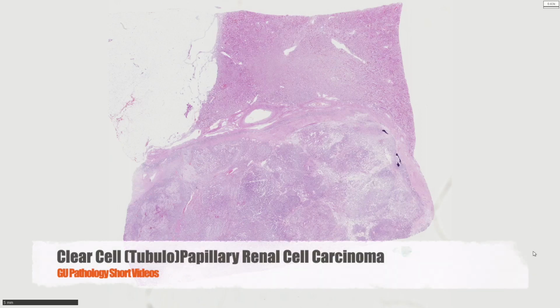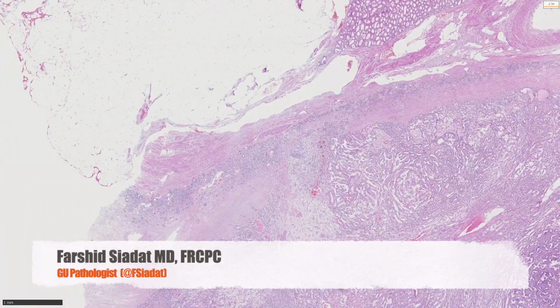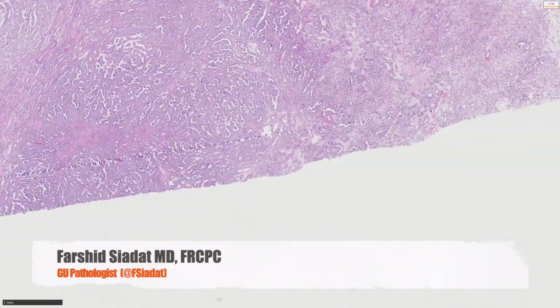In this video, I will share and review a distinct type of renal cell carcinoma which used to be under-recognized just a few years ago. However, it is in fact quite easy to diagnose once you know the criteria and see some examples of it. It is beyond the scope of this short session to be a thorough review of this topic.